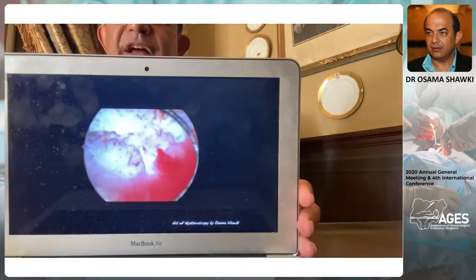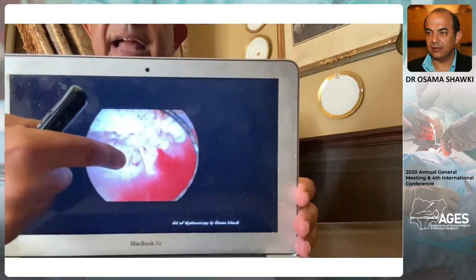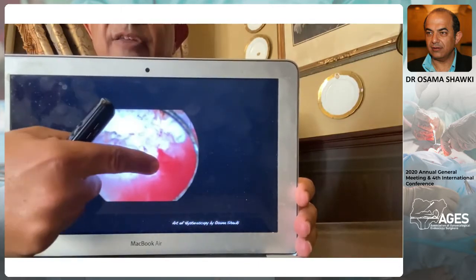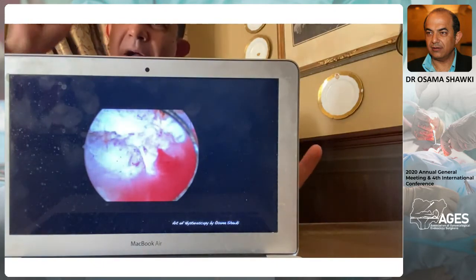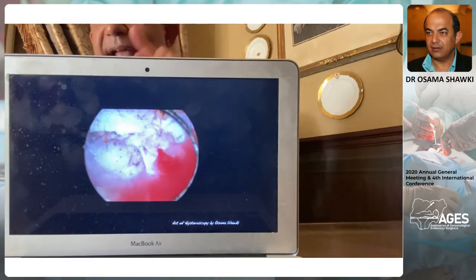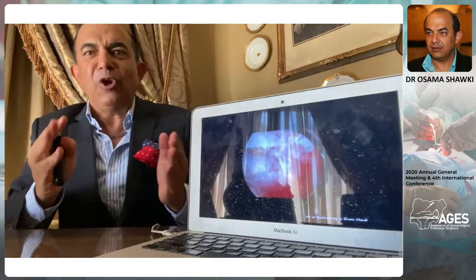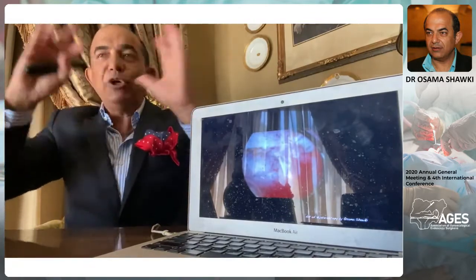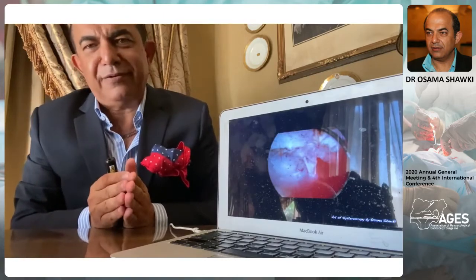Very rarely you suffer an eventual event like this, bleeding, a pumping vessel. At that moment, I know that my pressure is less than 100. So what you do is increase the fluid pressure to tamponade the vessel and go and touch. It will take 10 seconds. But if you keep at a low pressure of fluid, this pumping vessel will turn everything red. You will not find it. You will not reach the bleeder.